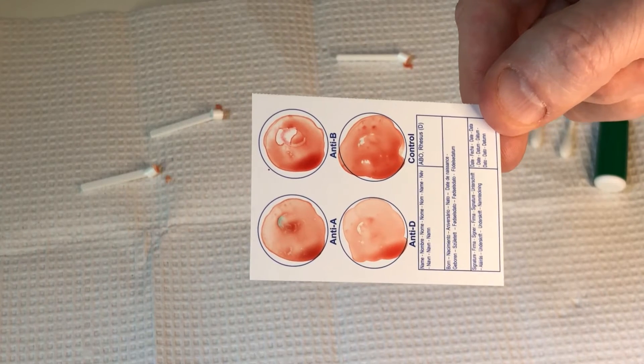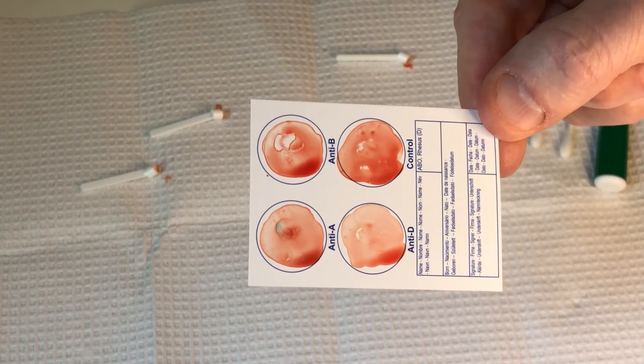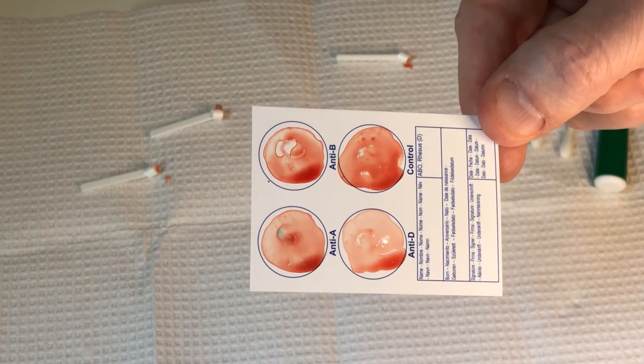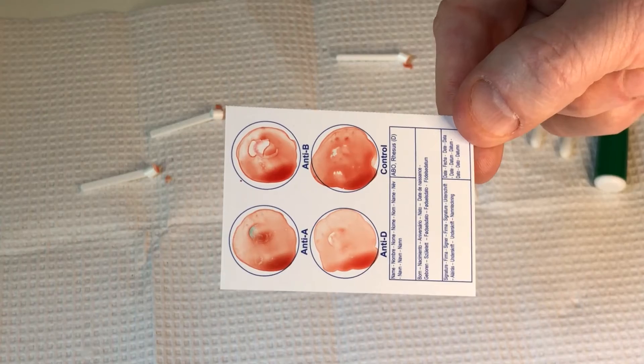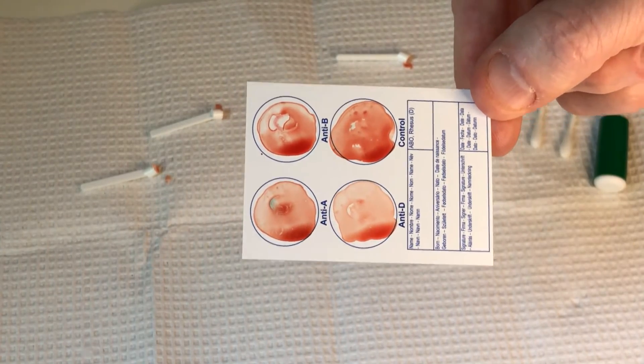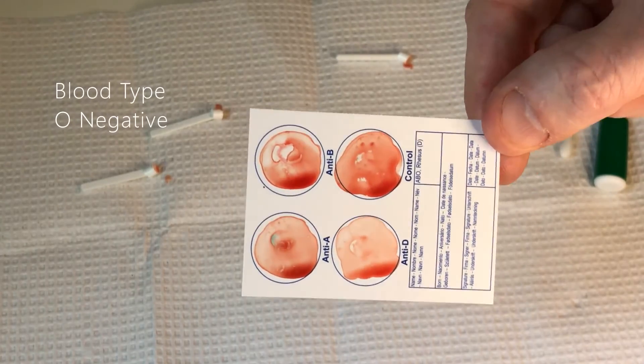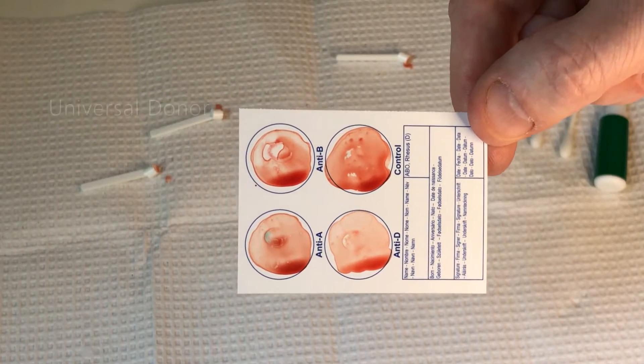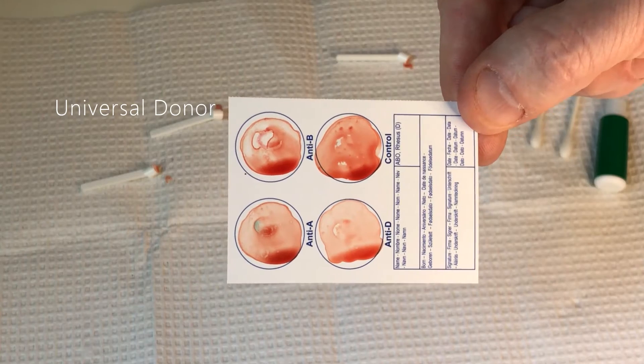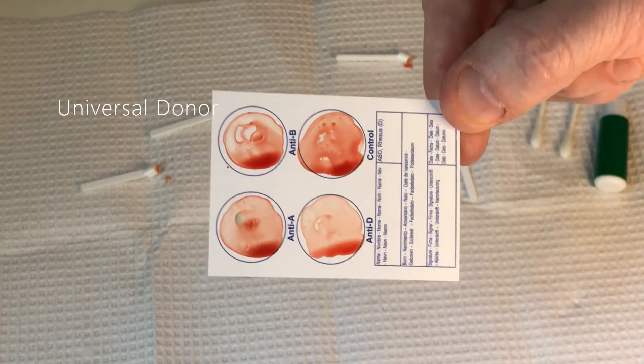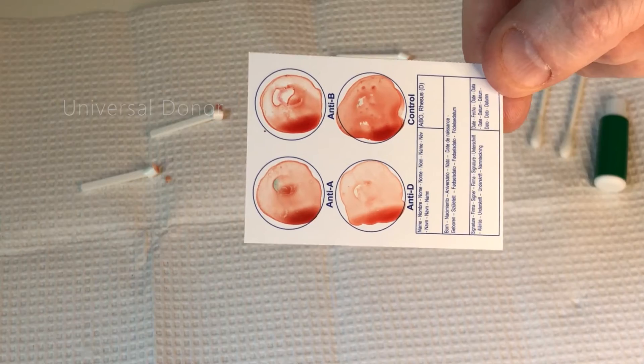What that means is I'm negative for all three of these antigens, which means I don't have the A type, I don't have the B type, and I don't have the positive. So my blood type is O negative, which as you may already know is the universal donor. I don't have any antigens on my blood, therefore I can give blood to anybody because they won't react negatively to it.